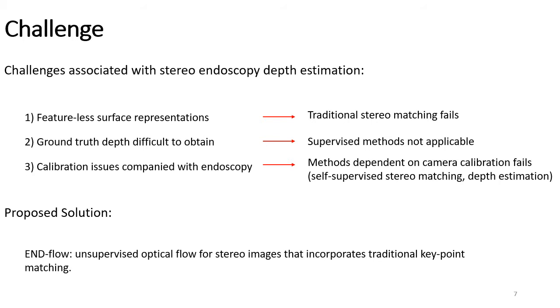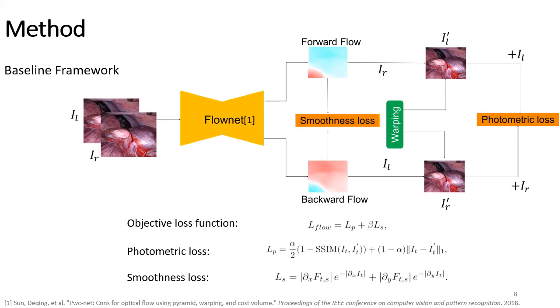To solve the previously mentioned challenges, we propose an unsupervised optical flow method to estimate the depth for stereo images. Here we first introduce the general routine to do unsupervised optical flow learning. An optical flow network predicts dense optical flows.